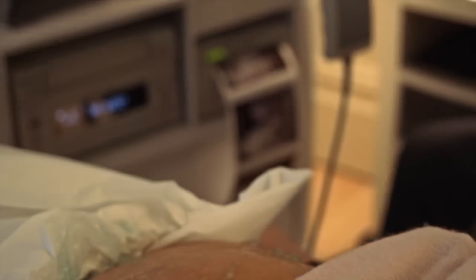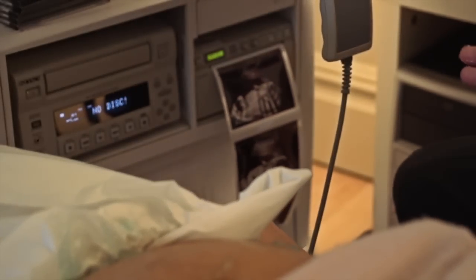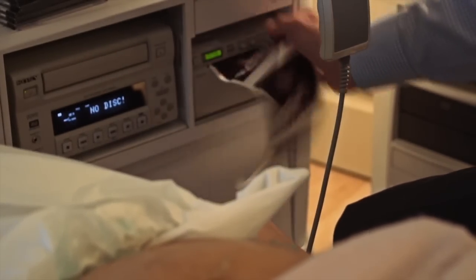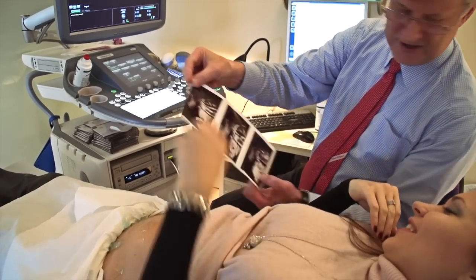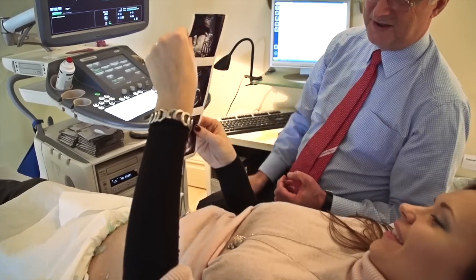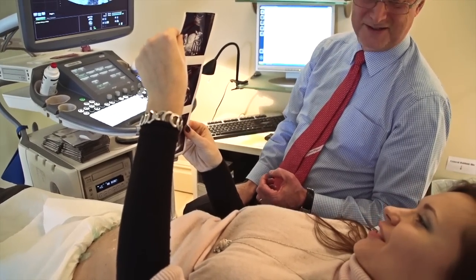The mother will get, in terms of material, a report showing the size of the baby and the sex of the baby, and she'll get several photographs showing the head and face usually and showing the sex.